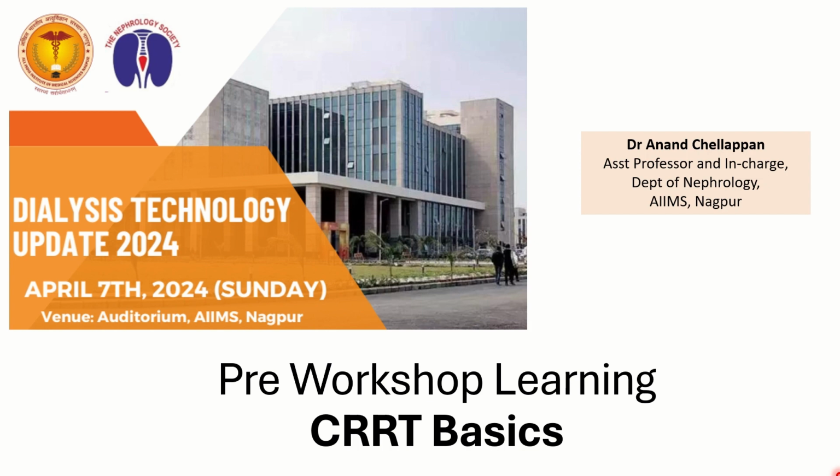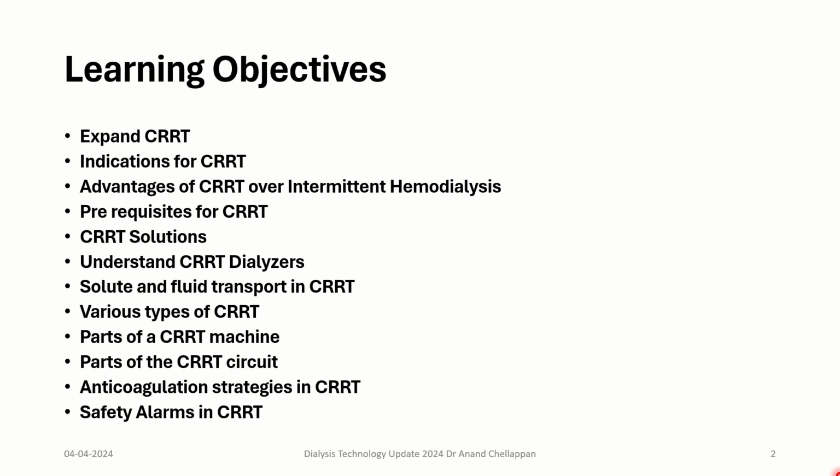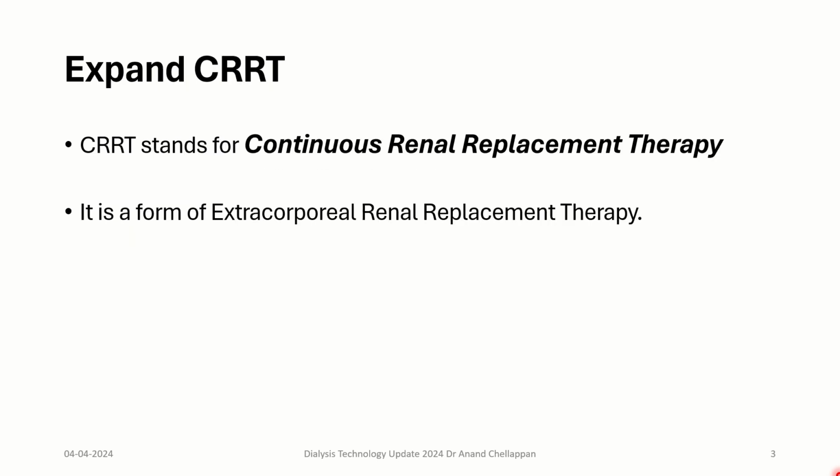We will be covering some of the basic concepts of CRRT in this presentation. These are the learning objectives of this presentation. The term CRRT stands for Continuous Renal Replacement Therapy. CRRT is a form of extracorporeal renal replacement therapy.